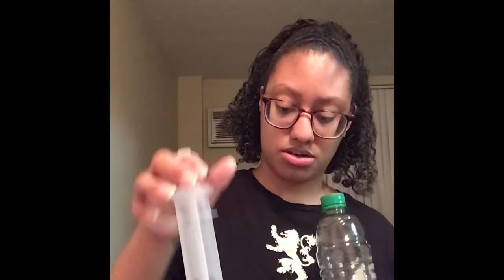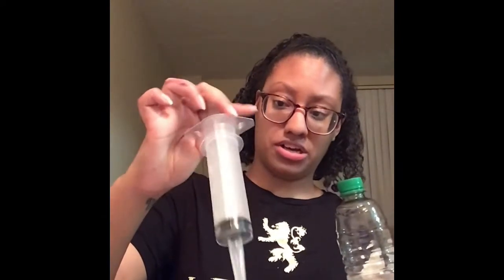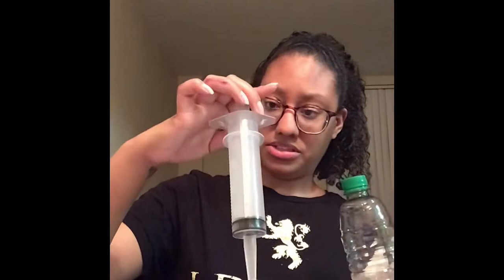We are going to pour in our solution. Again, make sure that it's the right solution. Make sure that it's not expired. When taking the syringe out, you want to be careful not to touch the part that goes into the bottle, but only touching these outer parts here.